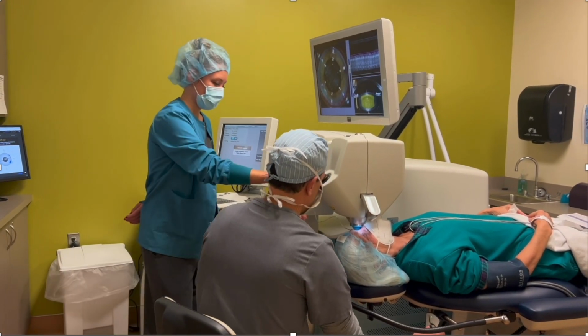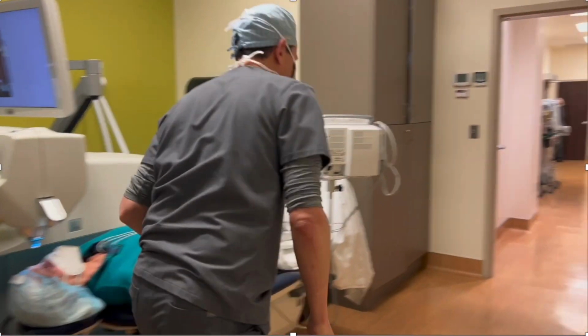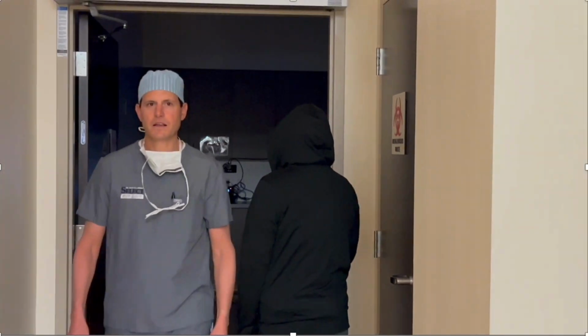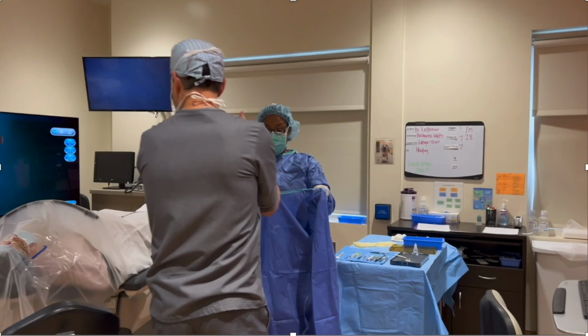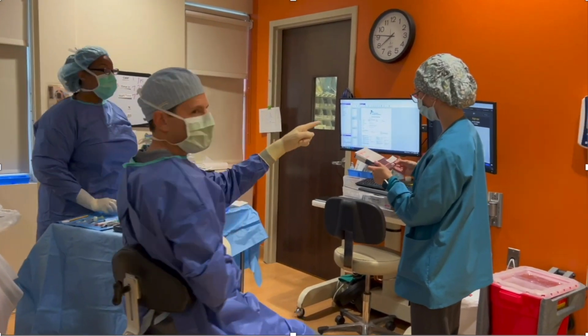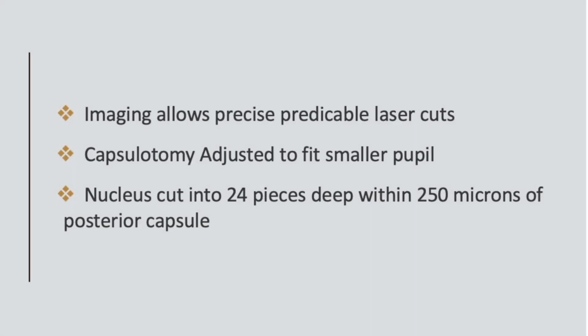A lot of times surgeons will do the surgery with the laser and make the pattern that they want, but then they kind of walk somehow between the laser and the OR, and they completely forget that they did the laser. And so they'll use the same phacoemulsification settings on their machine. They'll sit down and do pretty much the same surgery and use pieces of the technology of the laser, but not really fully leveraging the potential.